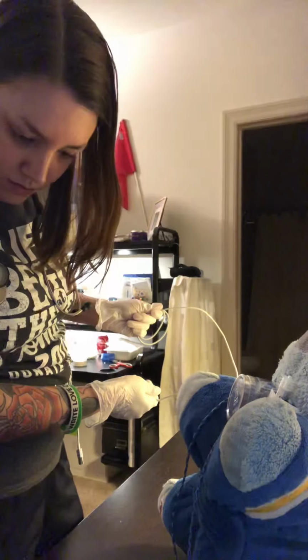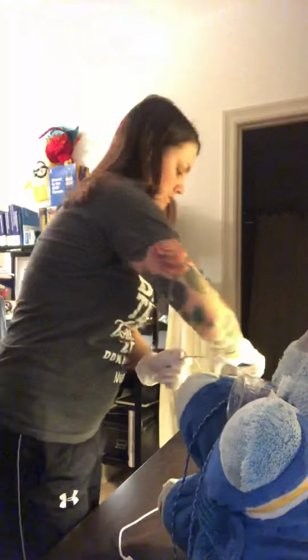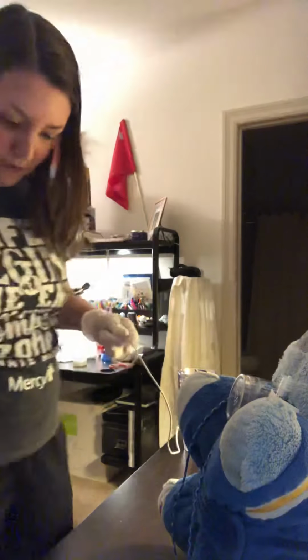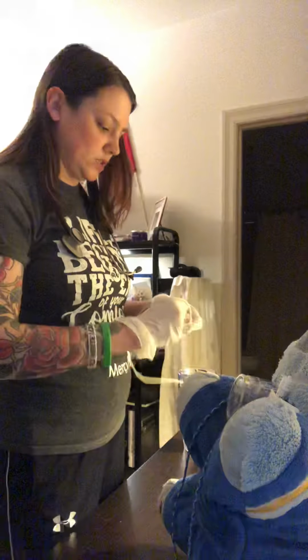With my non-dominant hand, I would turn on the suction device. This is where I would self-contaminate purposefully to turn on all my stuff. So I'm going to turn it on there, and this would be over here. Then I'll go ahead and connect the two together. I would then dip it into some saline to make sure it's working and suctioning correctly.